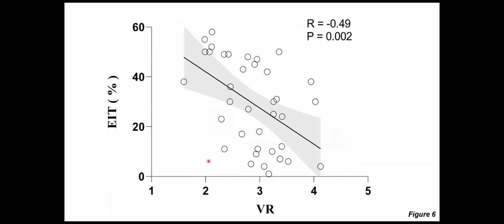Let's see some examples. And let's compare this score with some other scores or indexes that we use to analyze pulmonary emboli, or to make a suspicion of pulmonary emboli. For instance, this is the ventilation ratio. So it's an index of dead space used nowadays as a surrogate of dead space.